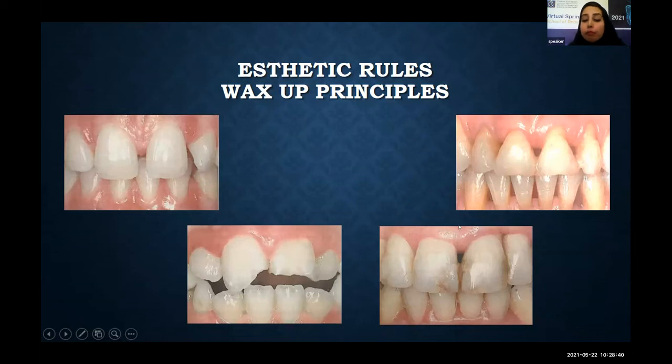And the third case is a person who has some caries and discolored filling, and also a previous crown. And we see lack of papilla here. And we should consider a different treatment for him or her.